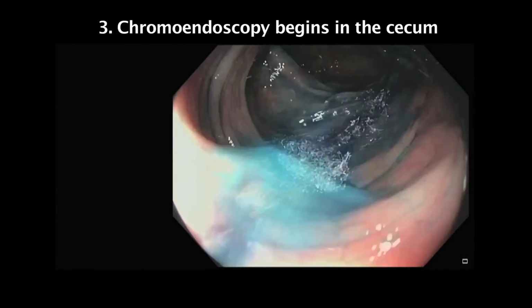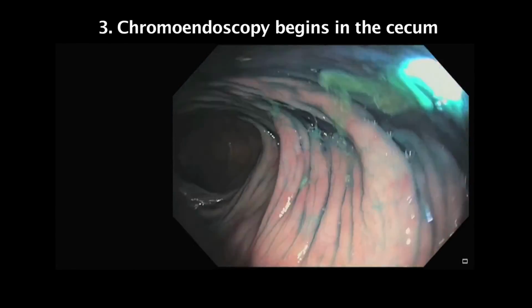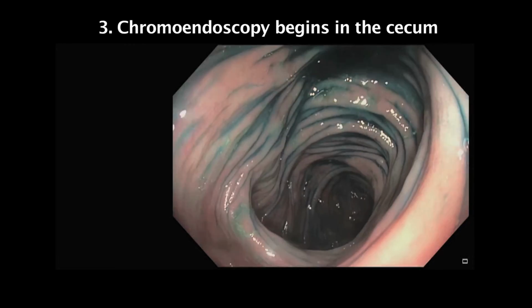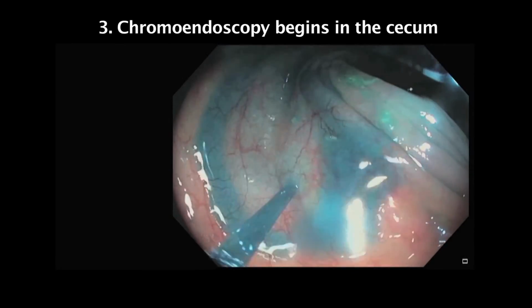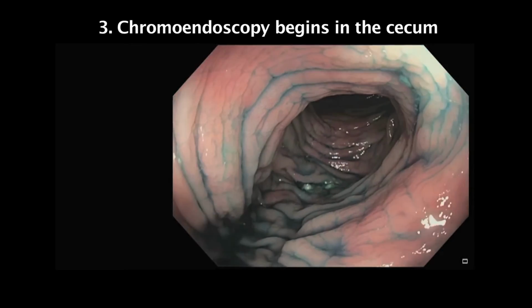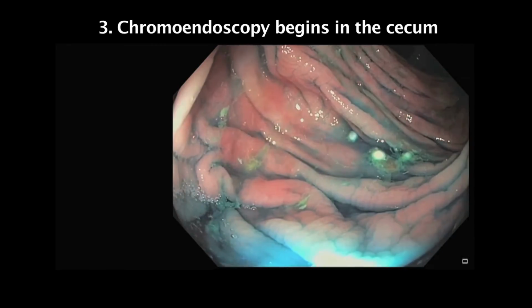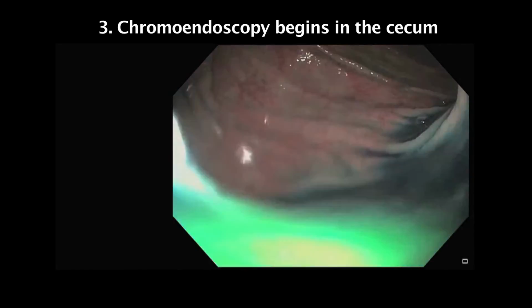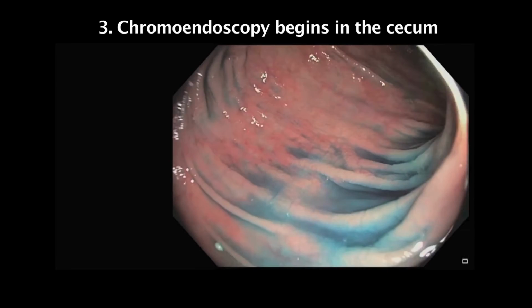After complete insertion of the colonoscope, examination with the chromoendoscopy begins in the cecum and proceeds methodically. During withdrawal, each segment is sprayed and carefully inspected. For optimal application and efficiency, use the foot wash pump for spraying and target the spray to the anti-gravity wall of the colon. Suction any excess dye that pools so that a thin layer remains and the mucosa is not obscured by blue pools. Expand and collapse the lumen with air insufflation and suctioning during chromoendoscopy examination.